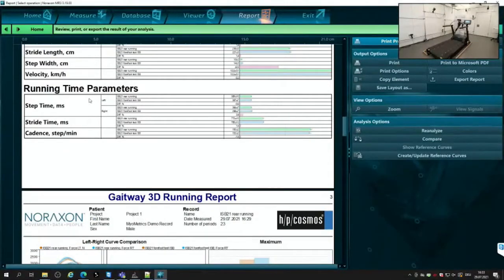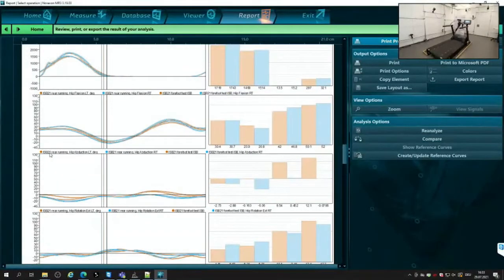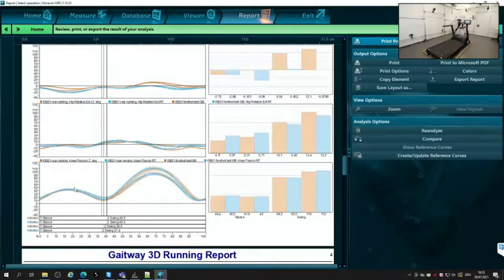We have our vertical force signals on page 3, where we can clearly see the comparison between the left and the right, as well as the two conditions, and in particular the forefoot running showing a higher peak force value through stance phase, as well as the elimination of that transitory peak force that you're seeing off that initial contact. As we continue to scroll down, we can see the kinematics that are plotted. In particular, one that we can highlight is this knee flexion angle, which for the forefoot running shows a little bit higher peak value during swing phase, essentially indicating that we are getting more knee flexion during swing, to help us prepare for that forefoot contact, get our leg around a bit faster.